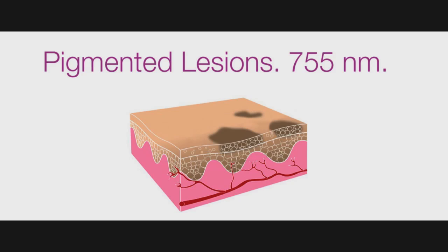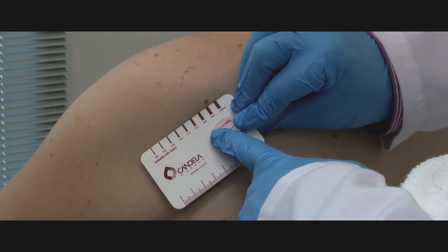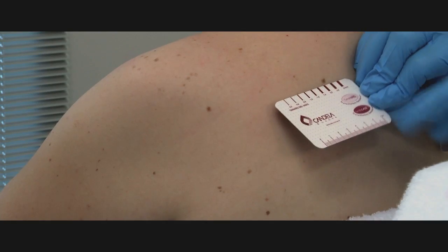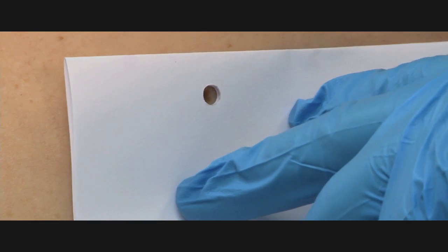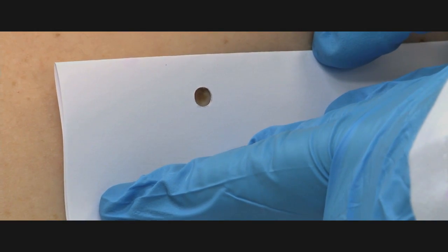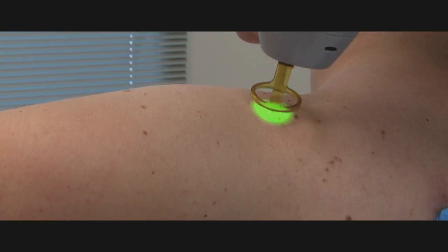Superficial pigmented lesions can be treated with the Gentle Max Pro using the 755 nanometer wavelength, which has a strong affinity for melanin. You can use a variety of spot sizes depending upon the size of the lesions. You may cover the surrounding tissue in order to protect it, or you may choose to use a painting technique in the case of a large number of lesions in skin types 1 to 3.